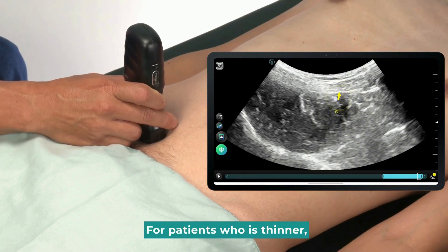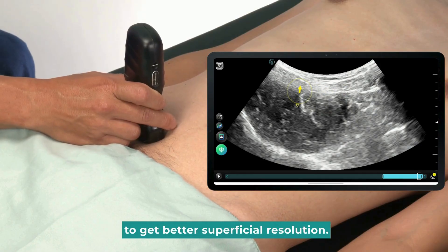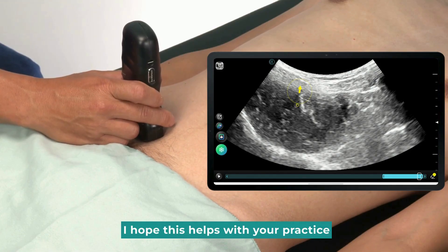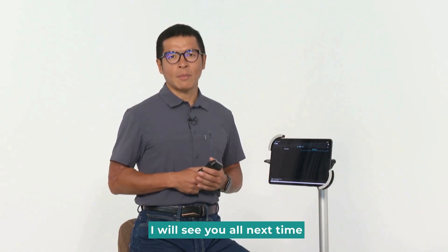For patients who are thinner, we can change the probe to a linear probe to get better superficial resolution and observe the appendicitis. I hope this helps with your practice. That's all for today's tutorial. I will see you all next time.